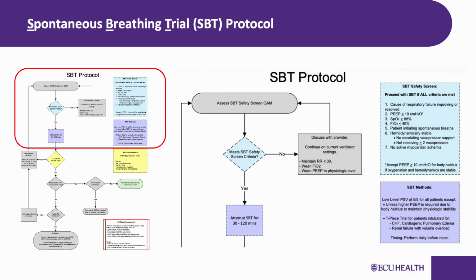That's our window. The trial needs to last at least 30 minutes to give us a valid assessment, and we cap it at 120 minutes because beyond that, we're fatiguing the patient without gaining additional useful information. Now pay attention to the two different methods of performing SBTs shown on this slide. This is important because the method you choose depends on the patient's clinical situation.